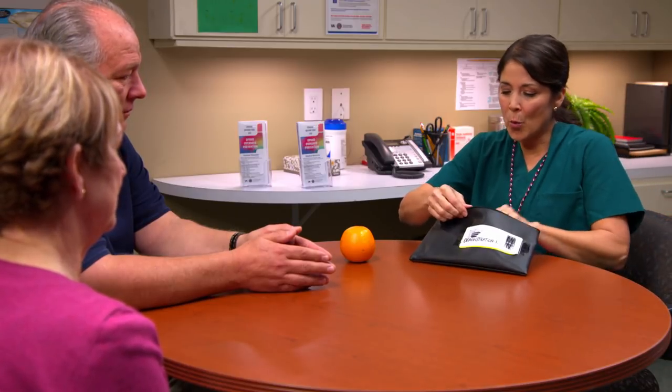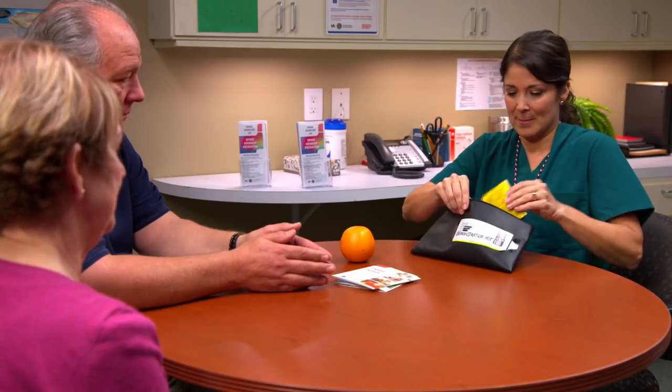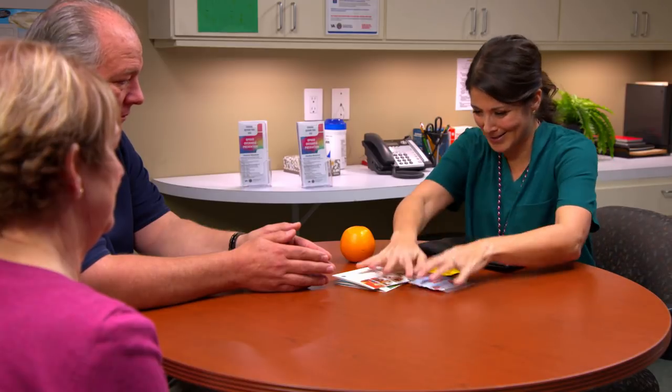So if you see those symptoms, the first thing you'll do is open up this kit and administer the naloxone. Then you'll call 911 and tell them what's going on. Now, we want the contents of this kit to be completely familiar to you, so let's go through it together right now. Great.